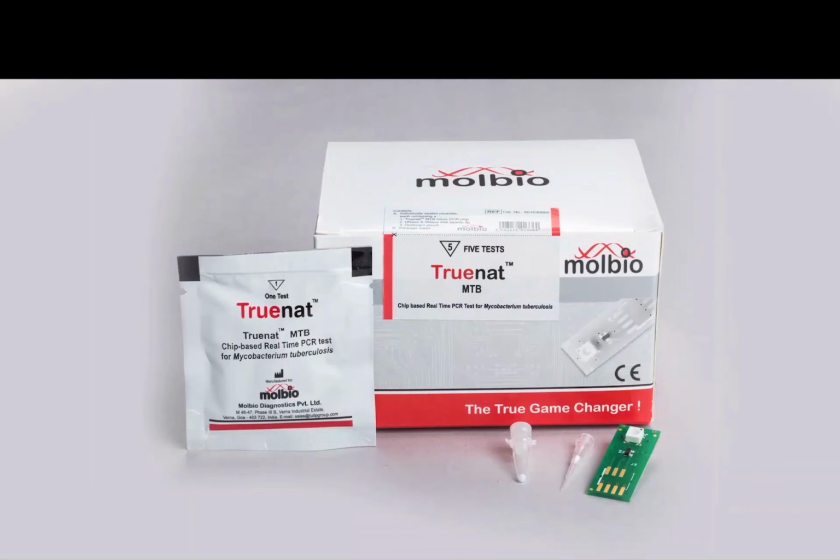Here we have different types of chips. The first one used in our program is the MTB chip. Here you can see the entire label is written in black. TrueNat MTB chip. Here you can see this green thing, looking like a SIM card. That is our chip.